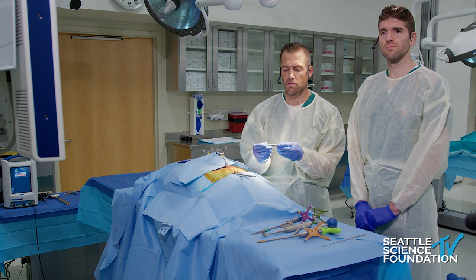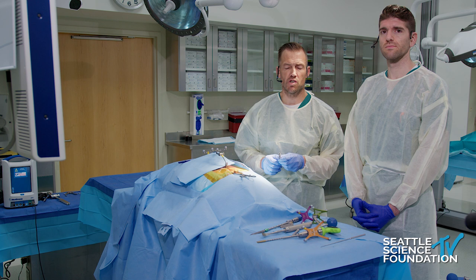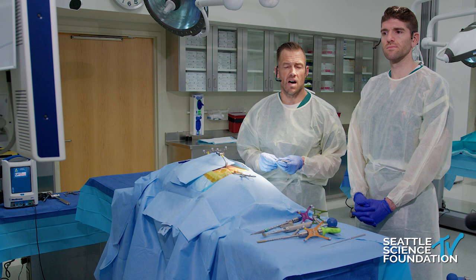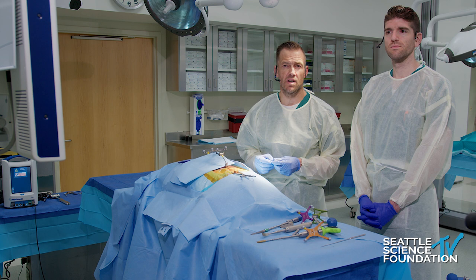This device is placed very similarly to a traditional S2 alar iliac screw, with the one exception that we're trying to maintain as much real estate as possible. These processes are made easier with intraoperative navigation — whether freehand or robotic assistance — but this procedure can also easily be done with intraoperative fluoroscopy by those familiar with S2 alar iliac trajectory screws.